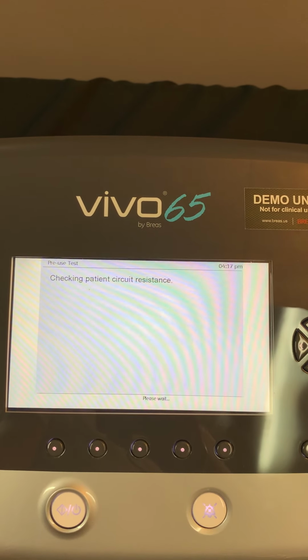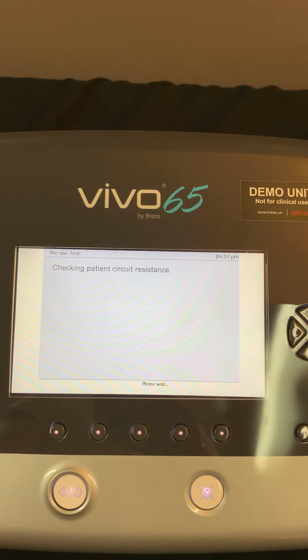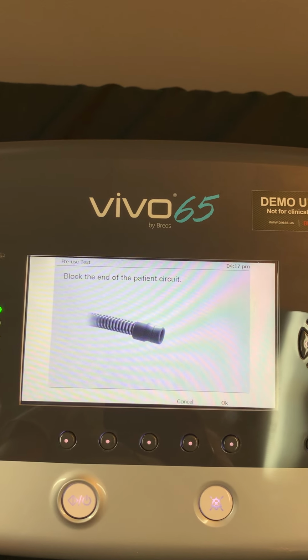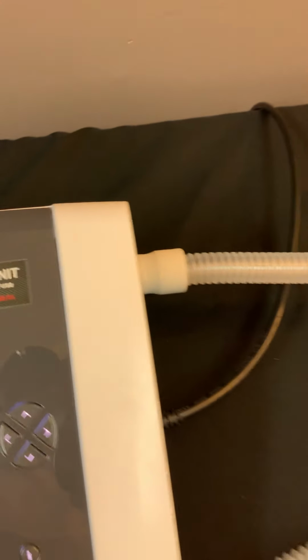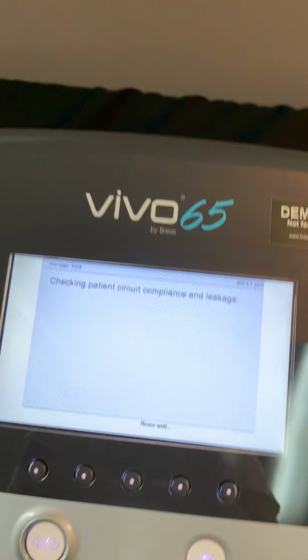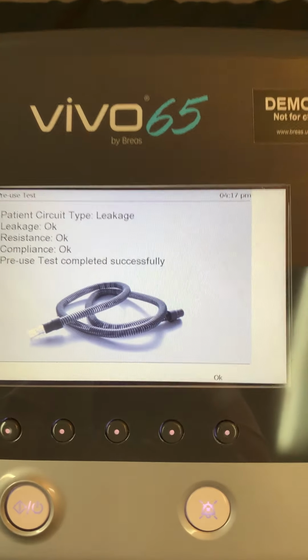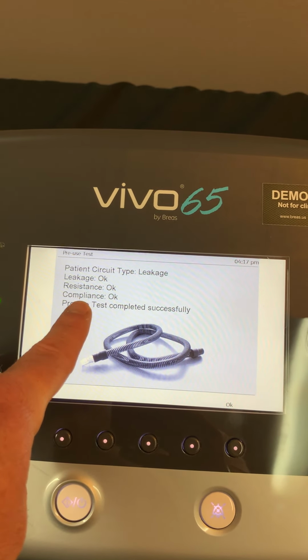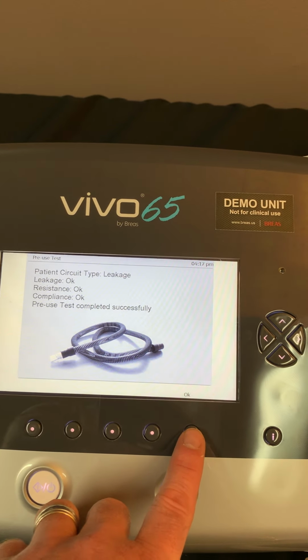So we're now doing a quick resistance test. And now we're going to block the end of the circuit. And we are going to click OK. And our patient circuit type is recognized as a leakage circuit. The leakage, resistance, compliance, everything is tested out okay, and we are ready to go.